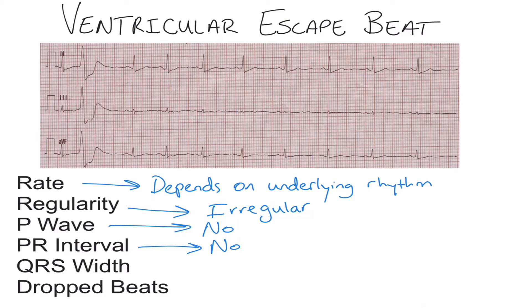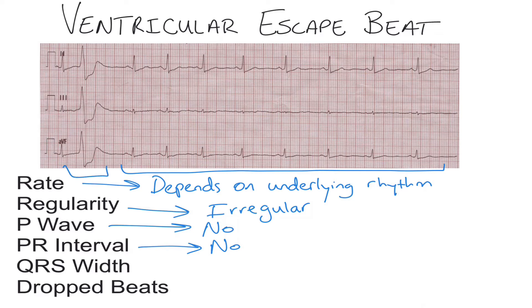You'll notice that in this strip there are P waves and PR intervals — that's because the underlying rhythm contains them, but it also contains ventricular escape beats. So while this rhythm might look normal from here to here, we actually have an arrhythmia with the ventricular escape beats. The QRS width on a ventricular escape beat is going to be wide and bizarre looking.